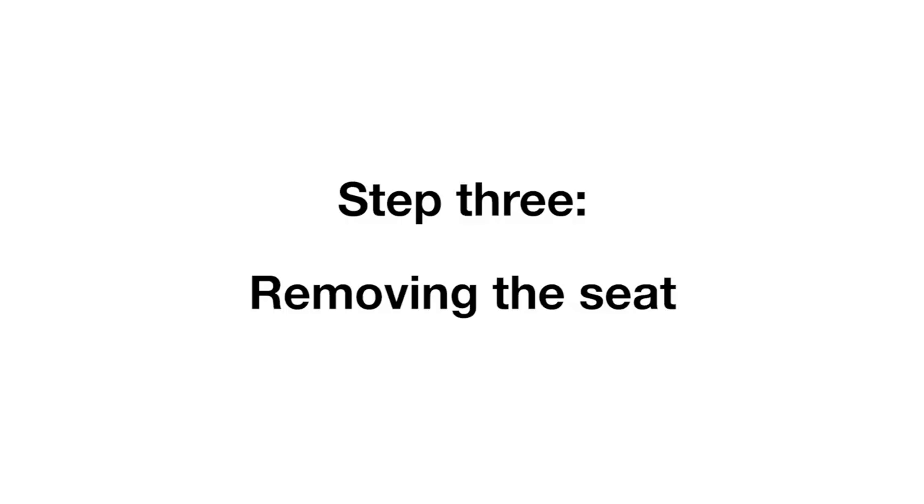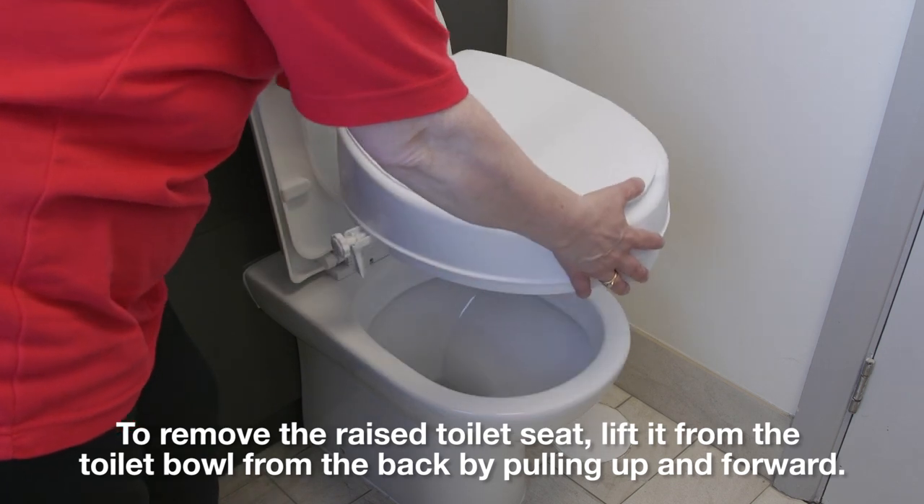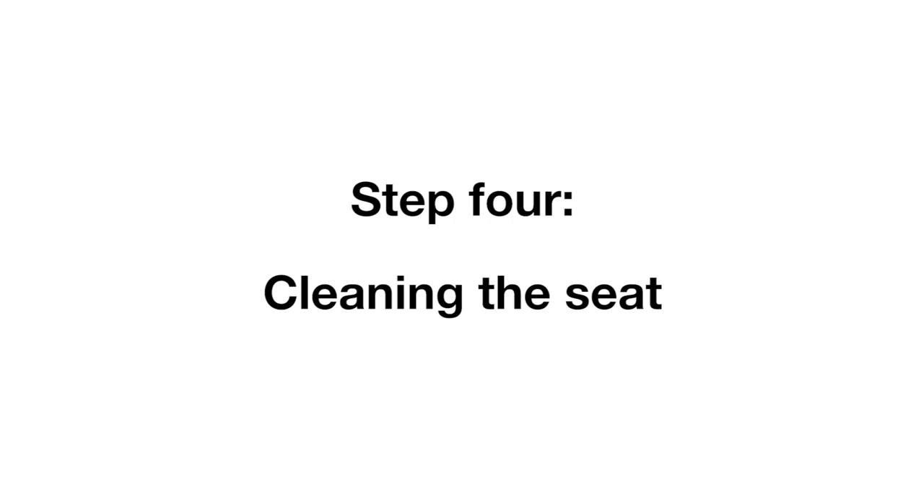Step 3 – Removing the seat. To remove the raised toilet seat, lift it from the toilet bowl from the back by pulling up and forward.